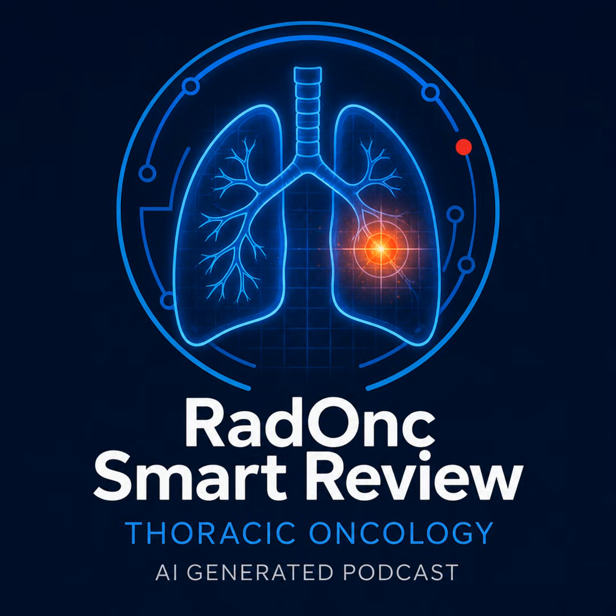You don't skip ahead. So let's dig into move 2, imaging completeness, because completeness is always question specific. What do you mean by question specific? Well, in thoracic oncology, we require multiple imaging modalities because literally no single machine is capable of giving us the whole truth. Exactly. A contrast-enhanced chest CT is completely unparalleled for defining the primary tumor's anatomic relationship to the surrounding structures: the pleura, the airways, the chest wall, the great vessels. It gives you the structural map.